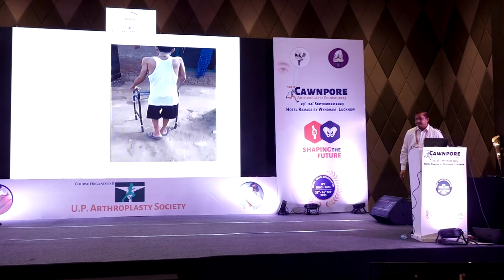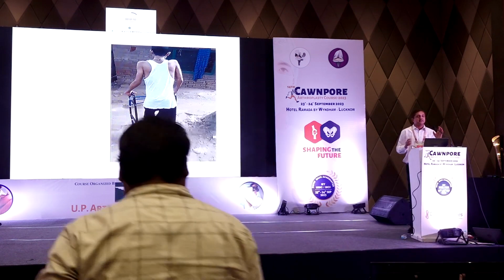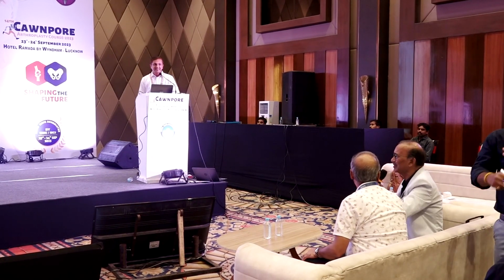My God, after seeing the X-ray, I never expected this outcome. Radiologically, what I thought was, even if it becomes loose, I will make a small acetabulum around it, and with time there will be some bone formation with the graft. Probably I will have to revise it after some time. But luckily, God has been kind to both of us.